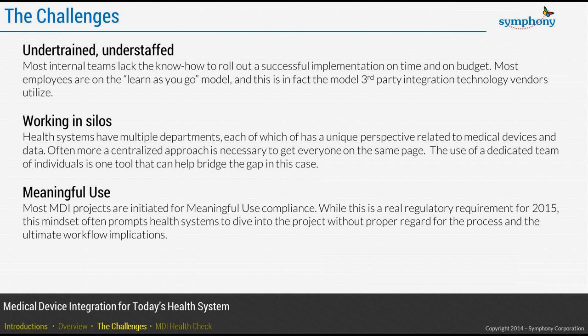And these systems are really pretty rugged, and so typically you don't have a lot of problems, but the problem that you do run into then is you've got these 2 individuals that have a fairly basic training, but if something goes really wrong, or if a device breaks, or if a new device needs to be added, typically those individuals aren't really set up to be able to handle that type of support.